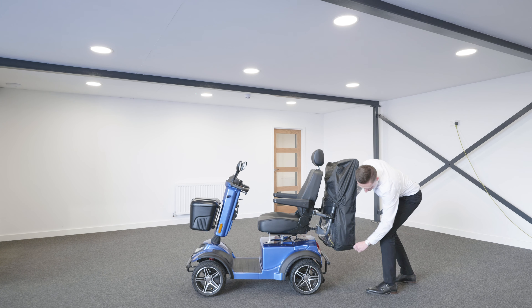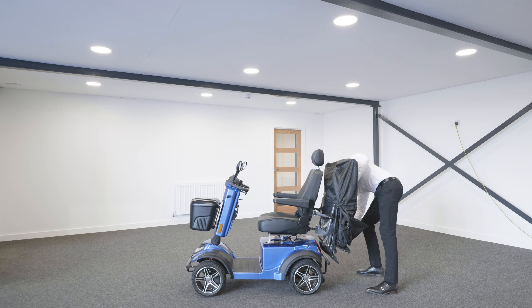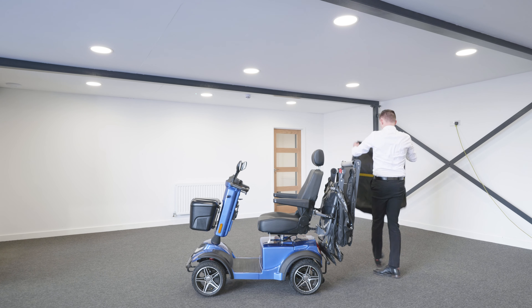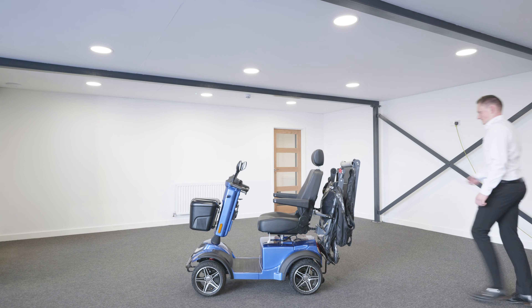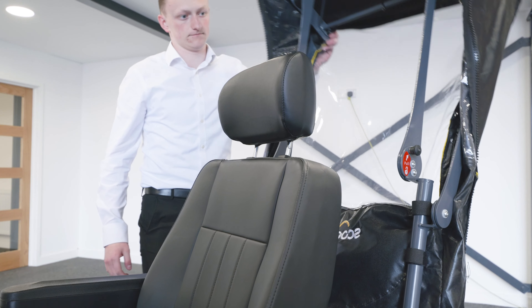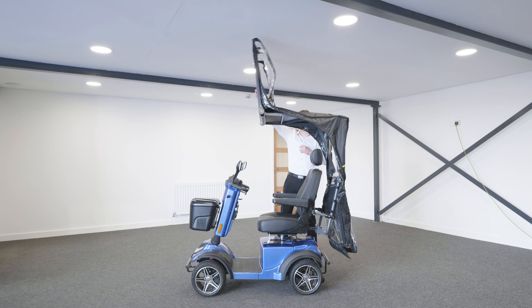Once assembled and secured to the mobility scooter, you are now ready to unfold the frame of the canopy. First, remove the protective cover. The frame can now be unfolded and opened into position. The plunger will click into place to ensure it is secure.